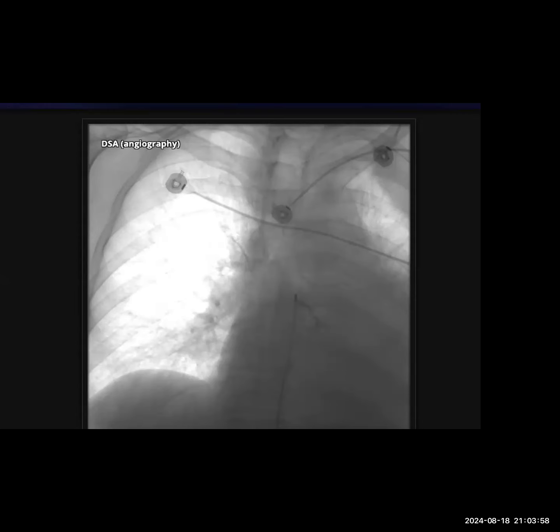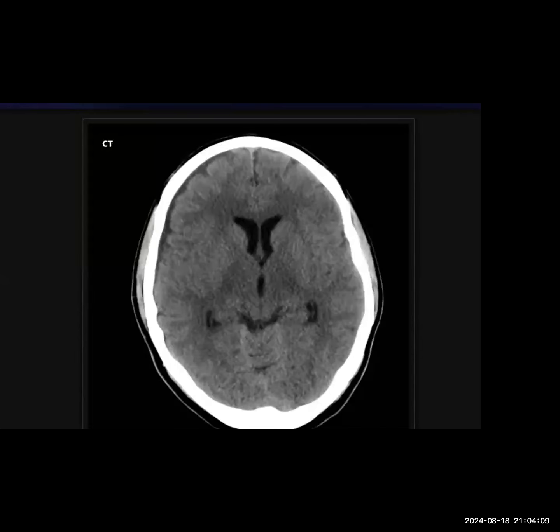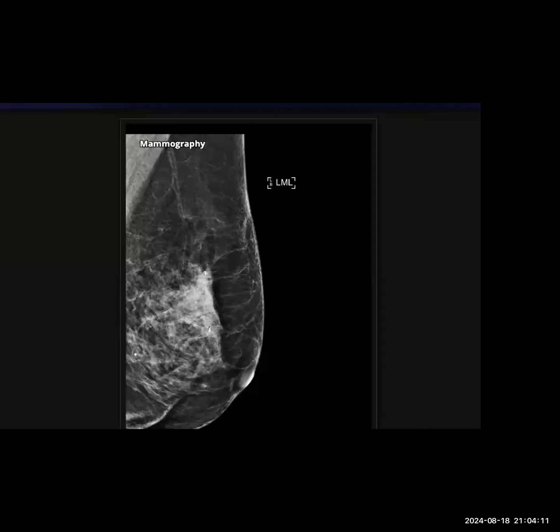I think specific would be that the patient should be stable. Anything else? I can't think of any, but I can think of no pneumothorax and all. We can go to the next case.